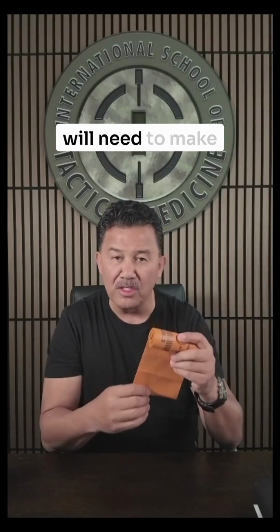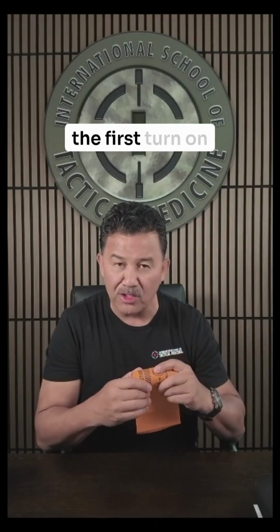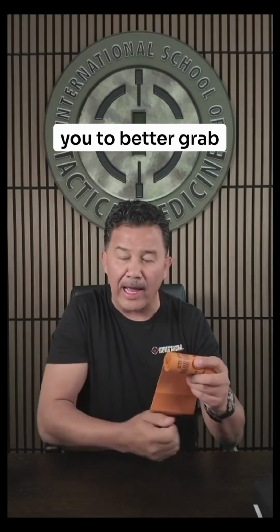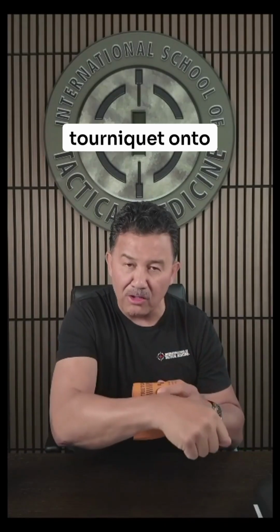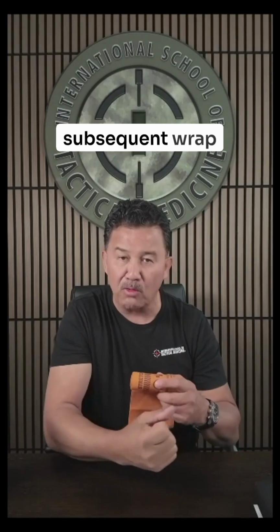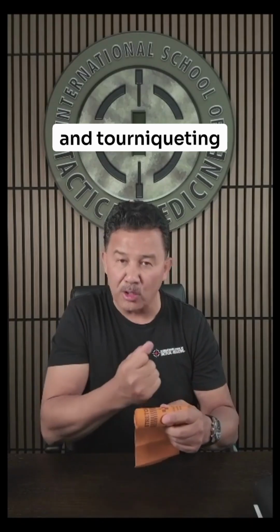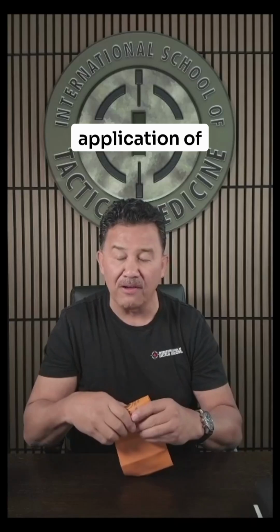Now, whether you're applying through self-application or victim application, it's important to remember that you will need to make sure that the leader of the tourniquet is closest to you before you make the first turn on that limb. This will allow you to better grab the tourniquet, hold it in place as you place the tourniquet onto itself and get that initial bite, so that every subsequent wrap around the limb can be applied with great force and tourniqueting pressure.